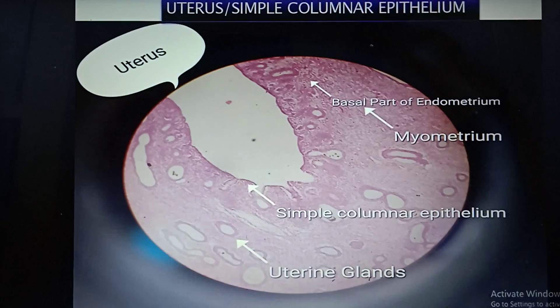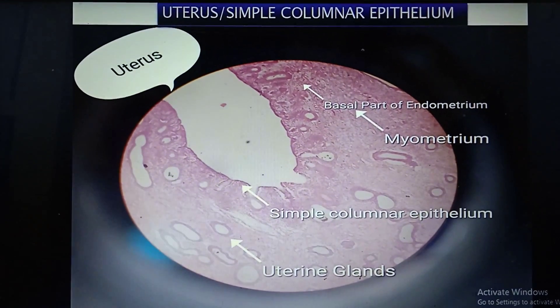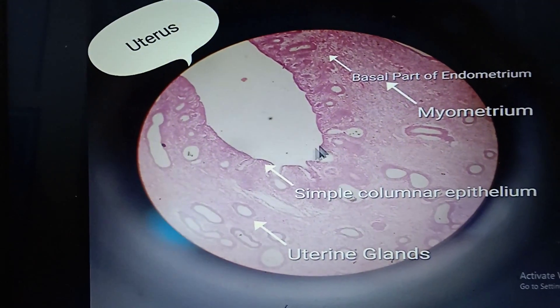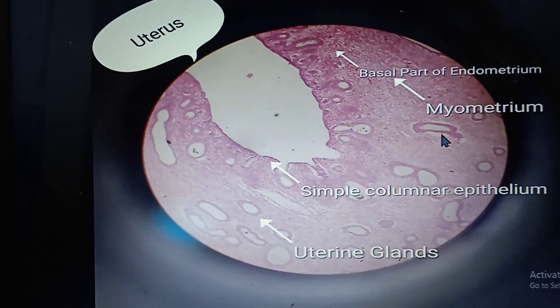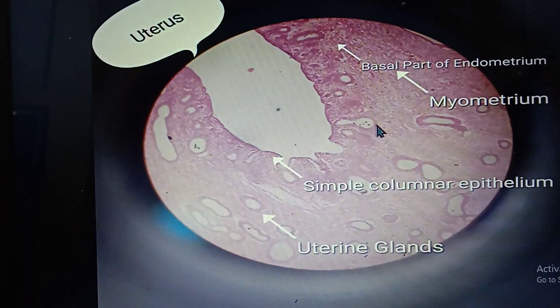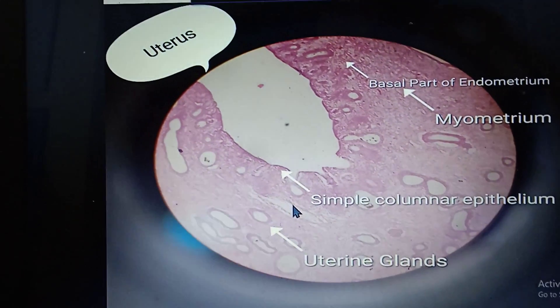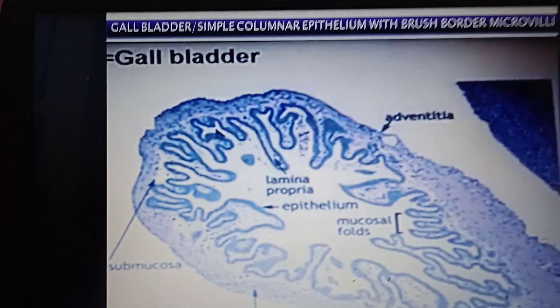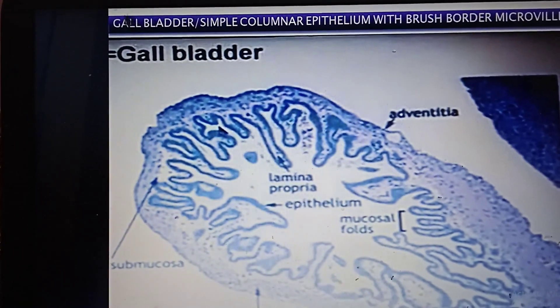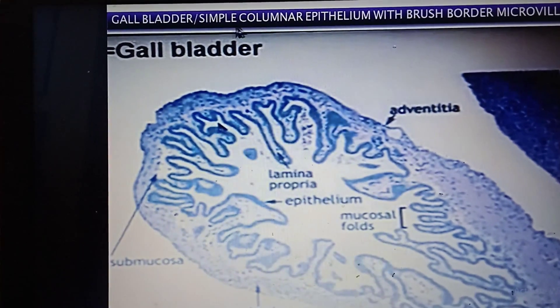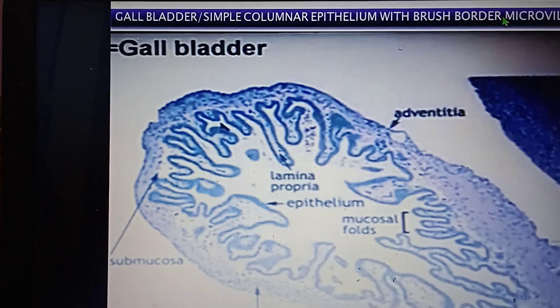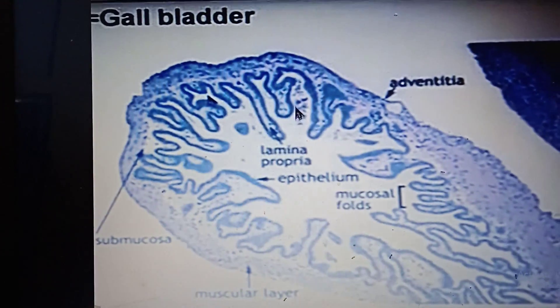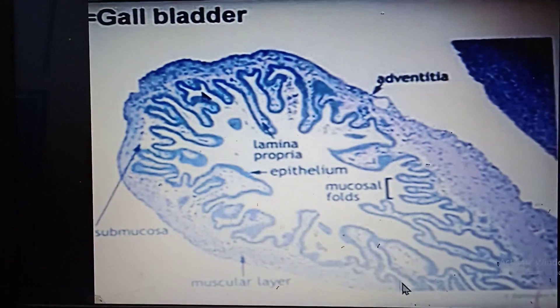This is the uterus showing simple columnar epithelium with glands, ducts, and blood vessels. Now this is the gallbladder — but if it is not in your syllabus and you have only covered epithelium, you have to write simple columnar epithelium with brush border microvilli. This is simple columnar epithelium having brush border microvilli with a flimsy mucosal fold.